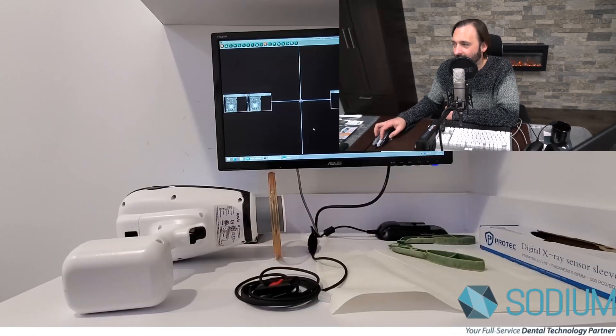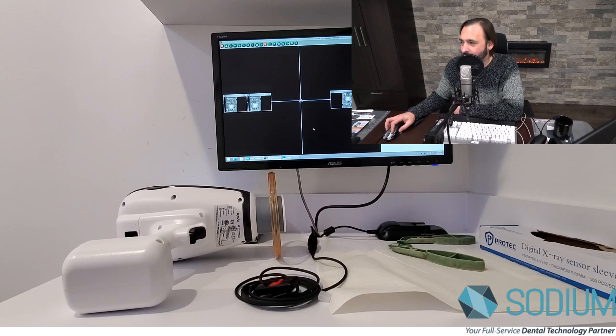I had a quick opportunity to set up — not the best video in the world, I apologize for that — but I had my hands on Dexus software, an Aurora sensor, and a Nomad. So I thought I'd quickly show you how the software works and how quick that TWAIN interaction is.